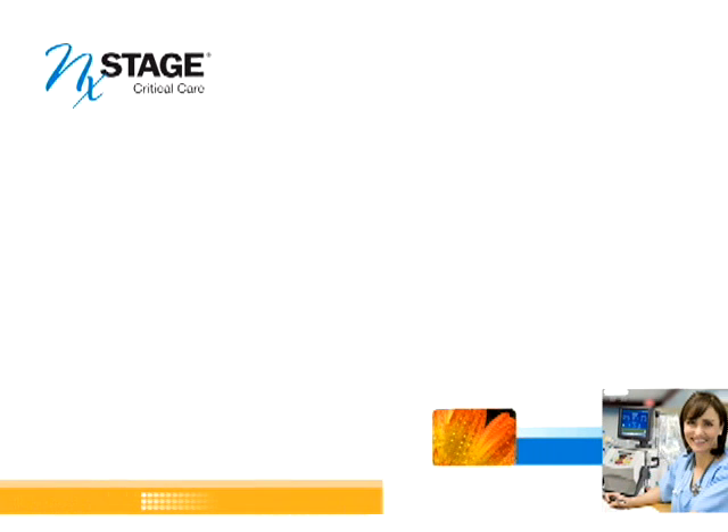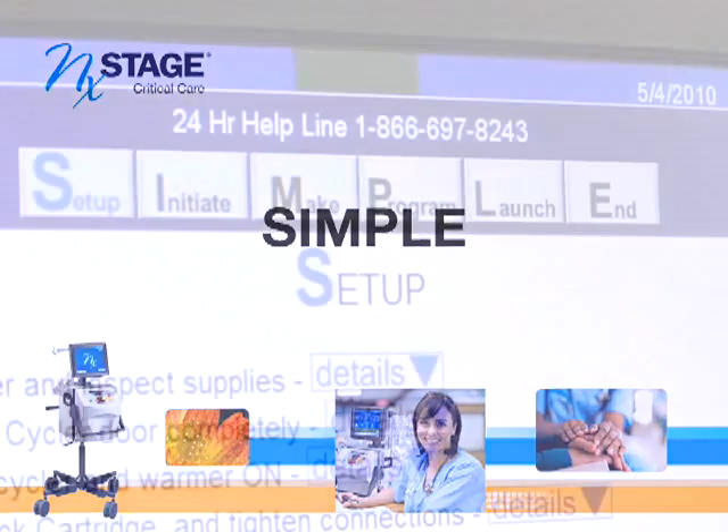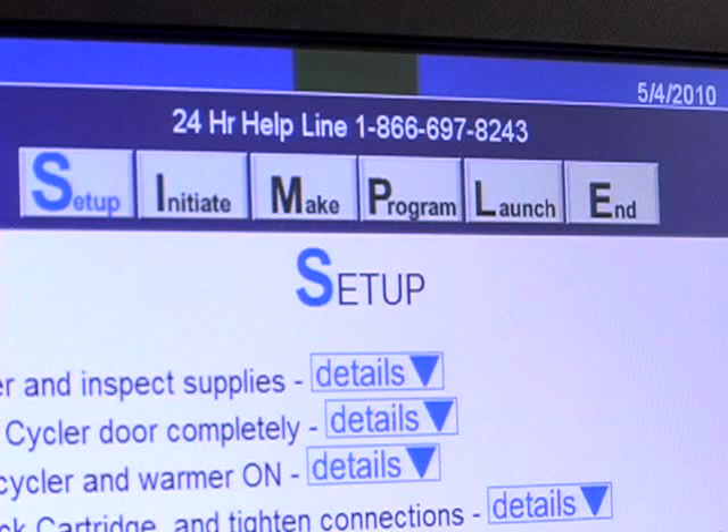You have selected the simple module. In this section we will review how to set up, initiate prime, make cartridge connections, program treatment settings, launch and monitor treatment, and we'll discuss end treatment.